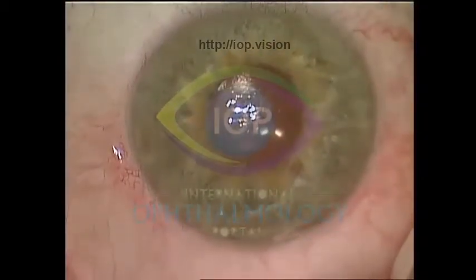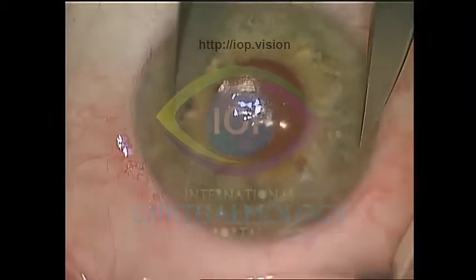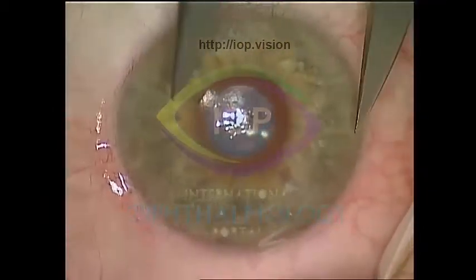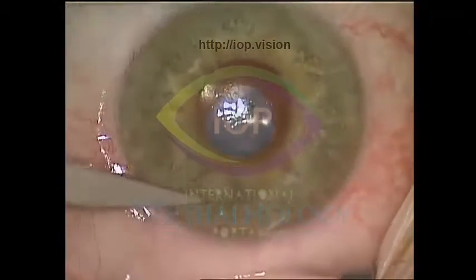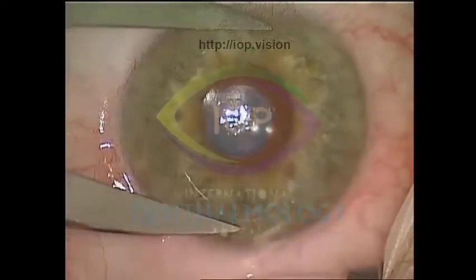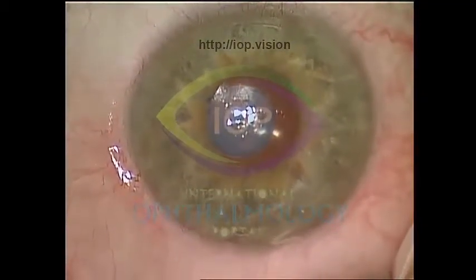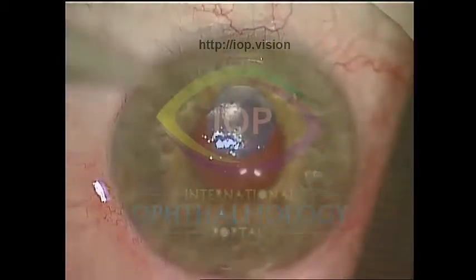I certainly, with the scleral incision, how shall I put it, it's a more conservative approach. It's more involved and includes making a peritomy and doing some cautery, probably closing the conjunctiva in some way. And I think that you're still making that same size incision. You're probably having more astigmatic effect by doing it in the cornea.